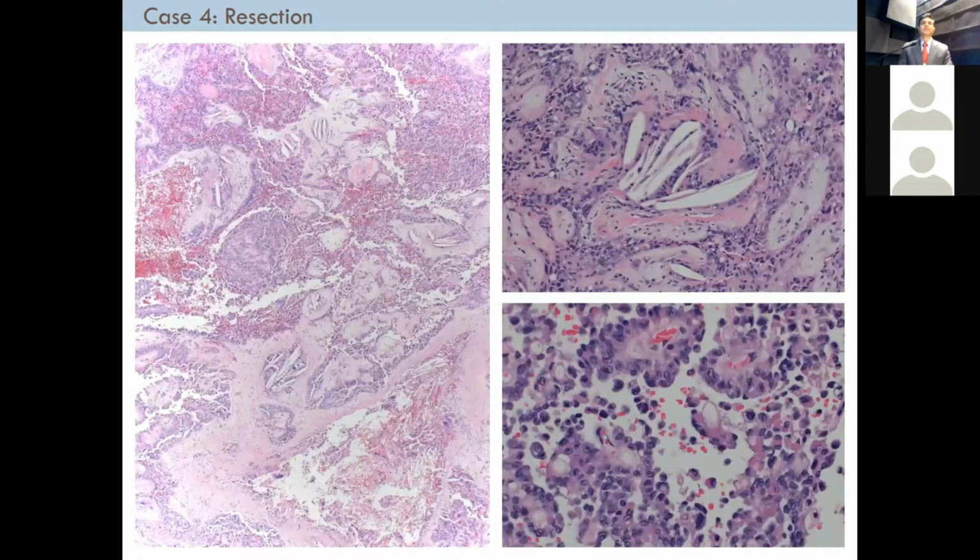The patient underwent a resection, which confirmed the cytological diagnosis. As you can see over here, it shows the classical morphology characterized by the presence of clefts with areas of hemorrhage, pseudopapillae with hyalinized fibrovascular cores, also some myxoid areas, and some degenerative changes like formation of cholesterol clefts. On high power, you can see the characteristic intracytoplasmic hyaline globules.